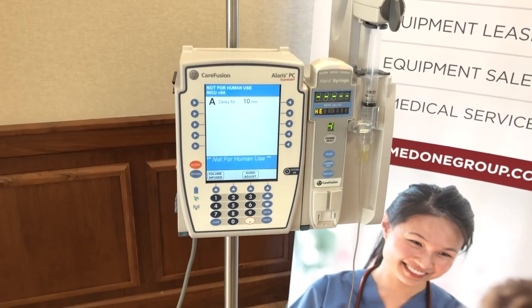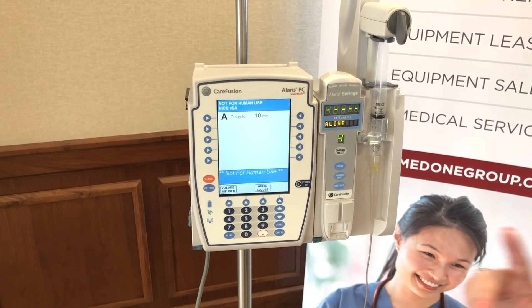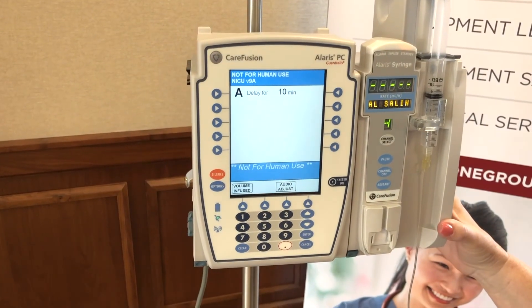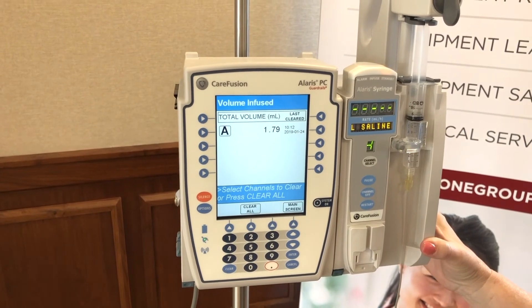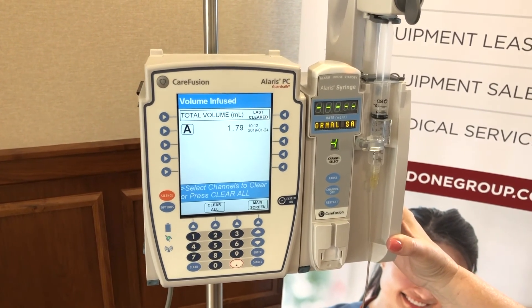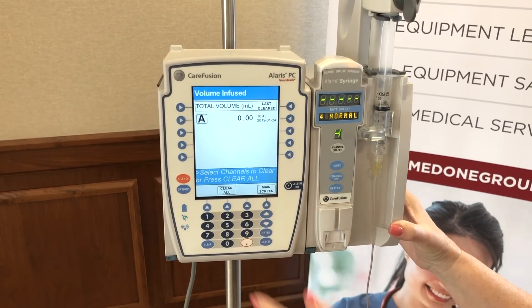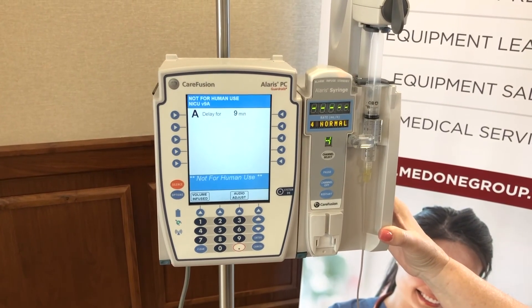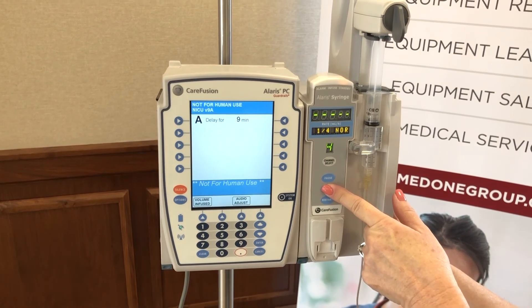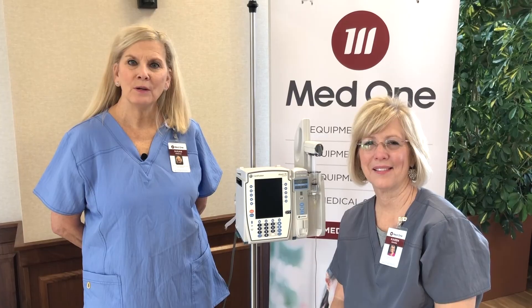To conclude, here's how you turn the infusion off — but first, ensure you've charted all infusions and volumes infused. The bottom left button on the PCU says volume infused: pressing it gives you all infusions across up to four channels, the total amount of drug infused, and the date and time it was last cleared. Write your numbers down, press clear all, and go back to the main screen. When your patient has a DC order, press and hold channel off until you hear a beep, then let go — the syringe infusion is now powered down. This concludes our syringe pump demonstration. Thank you so very much.